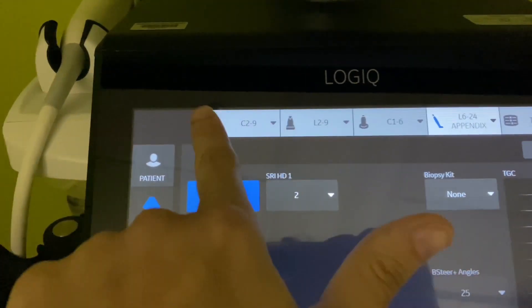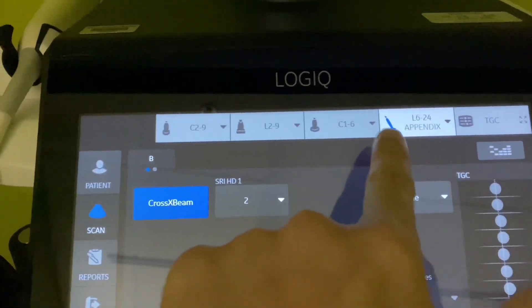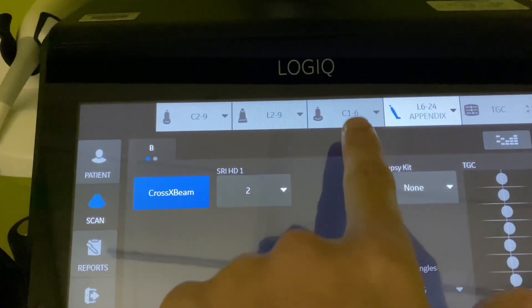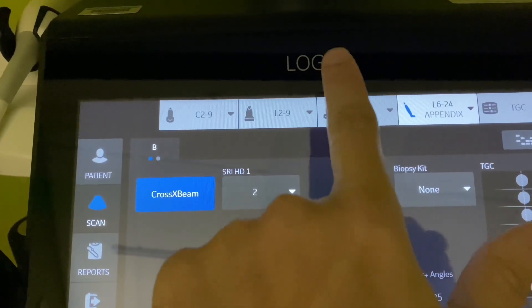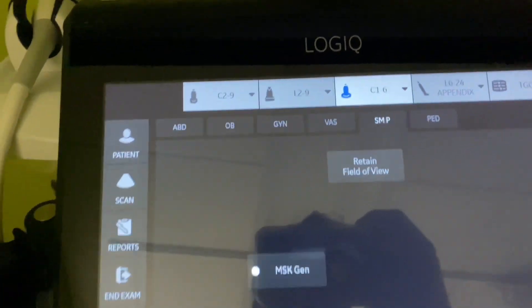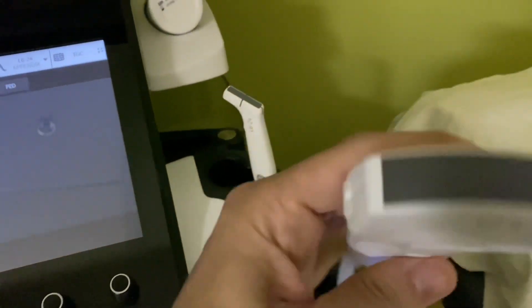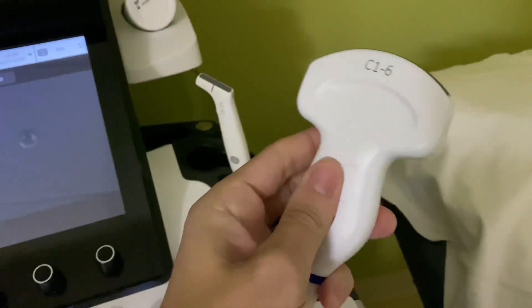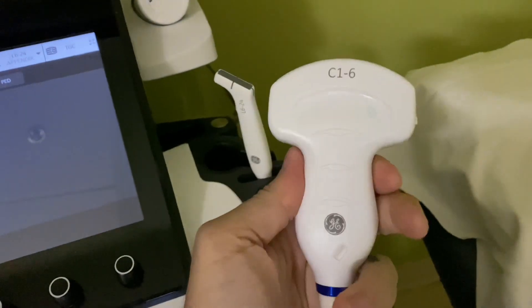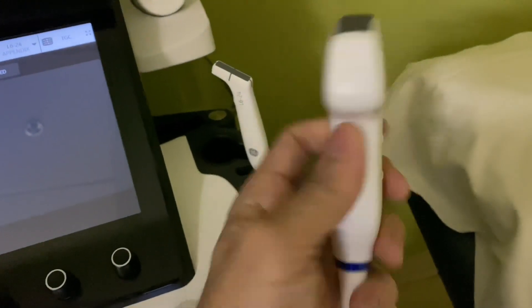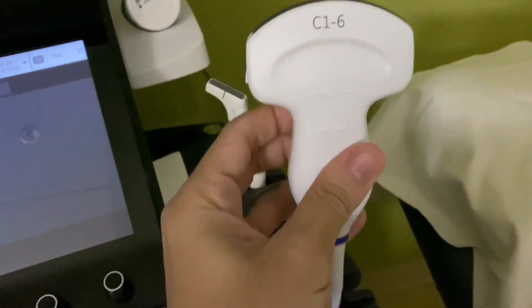All right, so once you have your patient chosen, you can choose whatever transducer you want. If you're doing an abdomen complete, you're usually going to go with C16. Now this is the C16, pretty much identical to the ones from the Logic 9. I'm sure it might have some maybe some updates, I don't know, but it looks very similar.